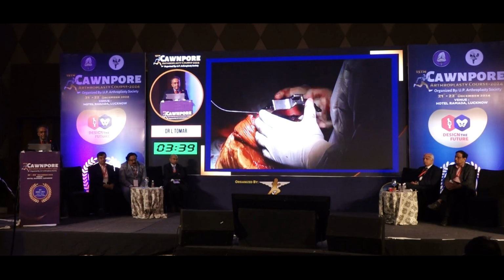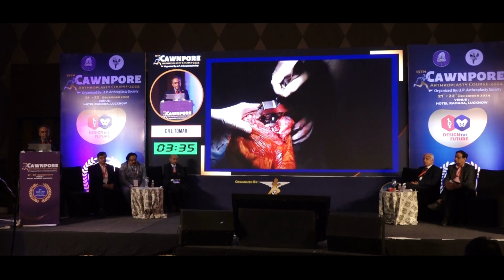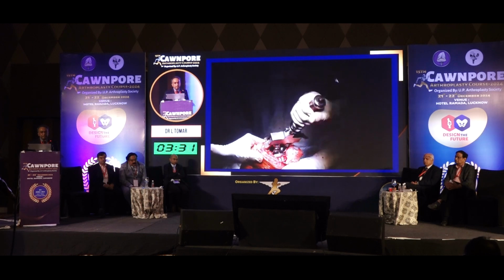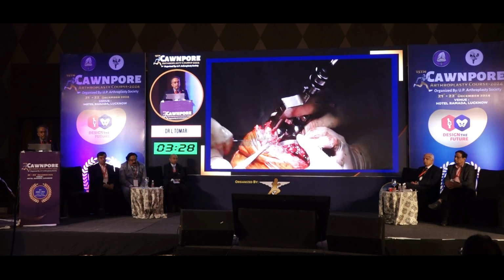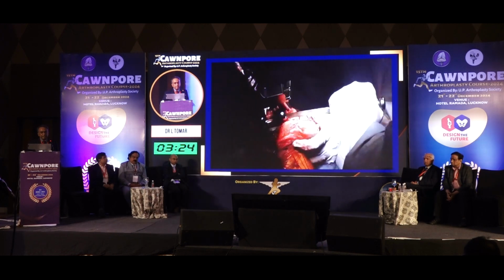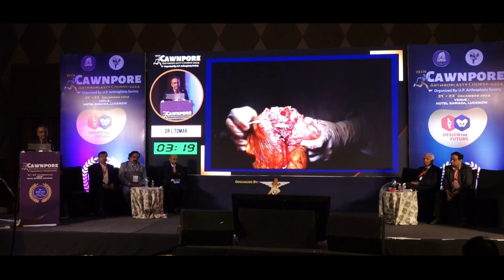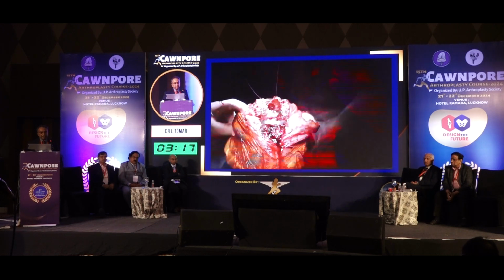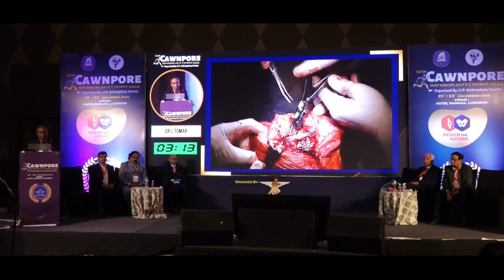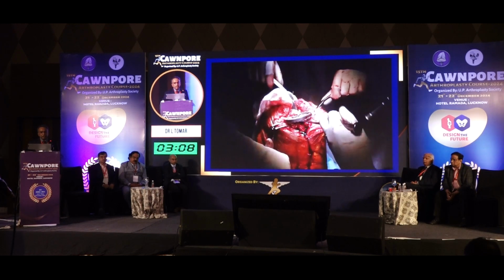Then when we think that adequate disengagement has been achieved, we can take it out with the extractor. But they have to be very gentle blows and never too hard, otherwise there will be a significant loss of bone and it may take out a chunk of bone along with the cement. When it is not removed, again try to find out where it is stuck, and after a certain time we are able to remove it. Then collect the samples, and if the medullary canal is open, take samples ideally from the medullary canal also.